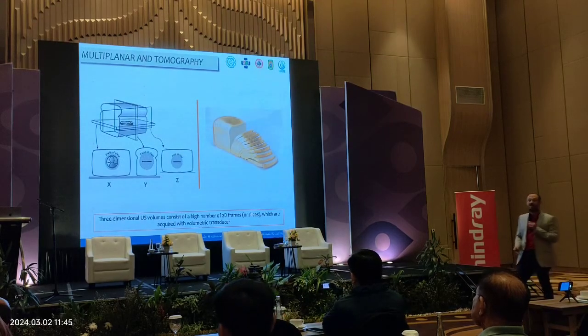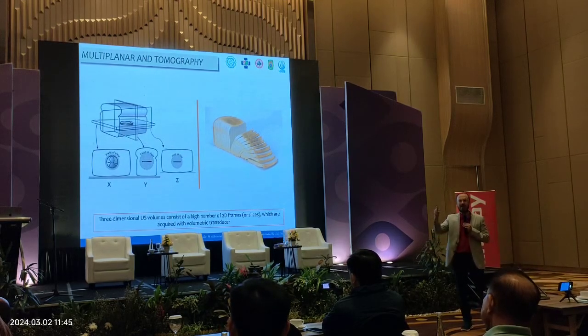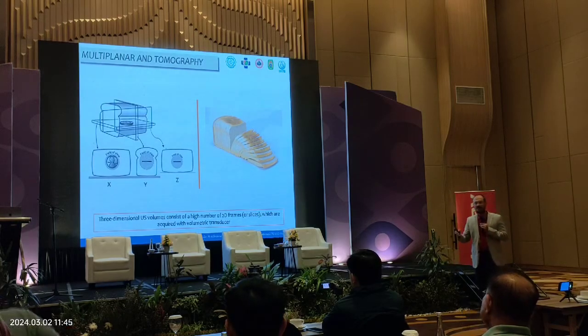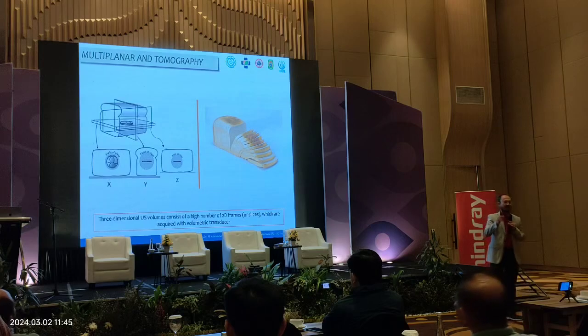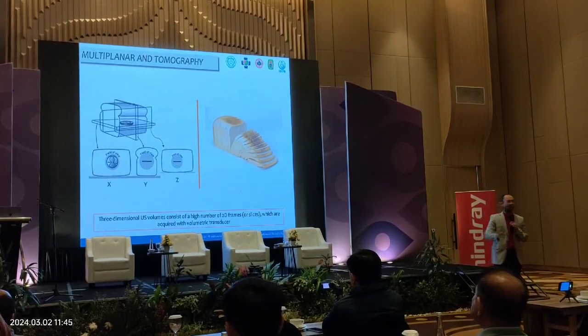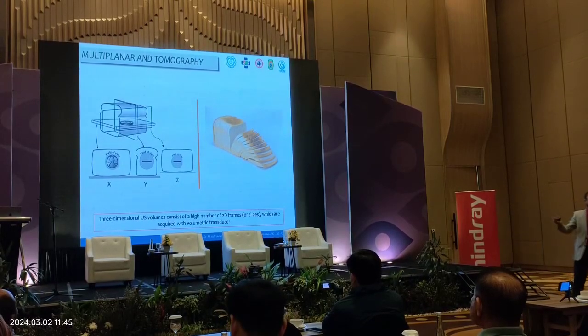It's different. It's like slicing the bread in the same plane, parallel, moving forward or moving backward, and it is related to what we want to see: how many slices we want to use, and how much thickness we should use for the slicing. This is the fundamental aspect of multiplanar and tomography. So please keep this in mind.